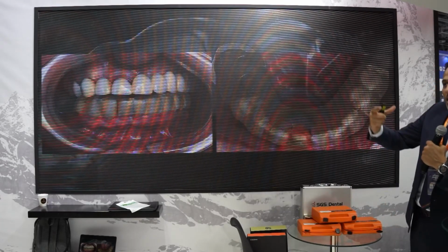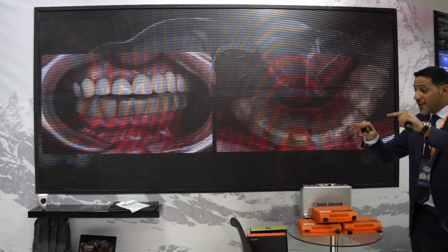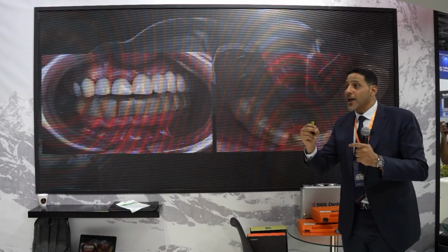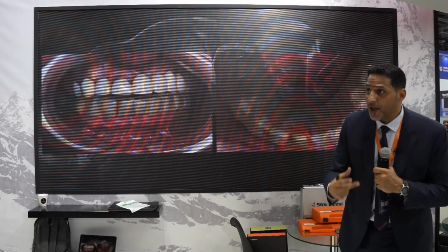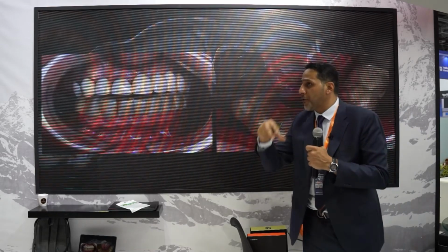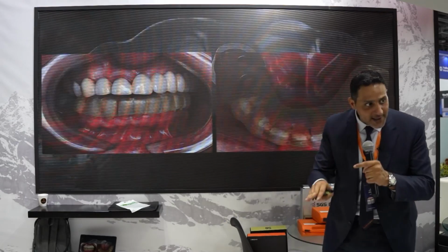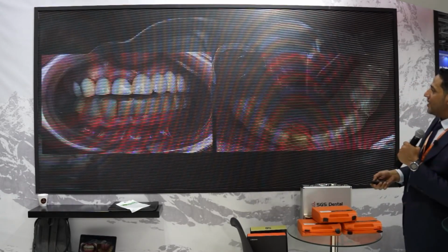Check the surgical guide. You have to put it in the patient's mouth. Check that it is not rocking. This is the first thing. If you want to use material, we call it fit checker. It will show you where it binds or shows through, so we have to remove it. It's like an adjustment material to make sure it is fully seated, because we're talking about millimeters, very small amounts of error. Okay?